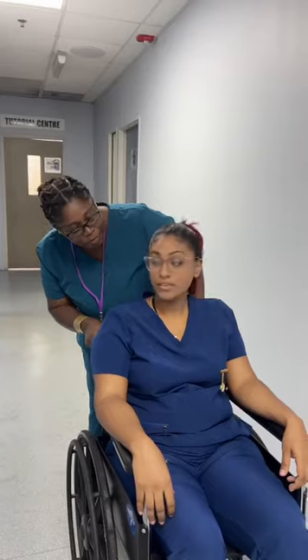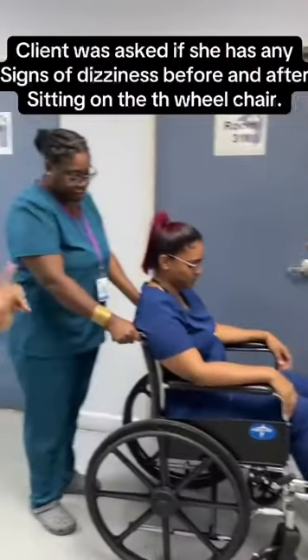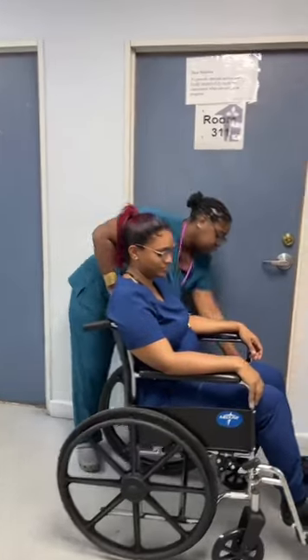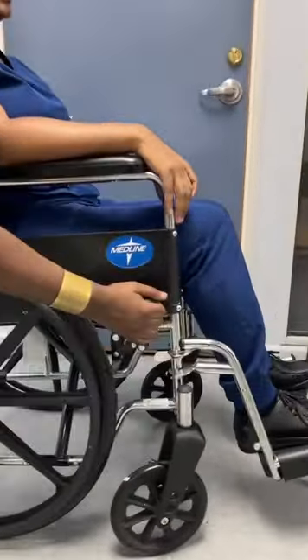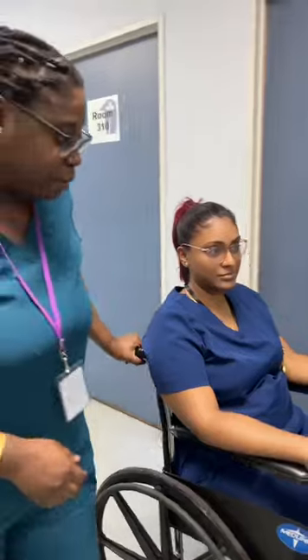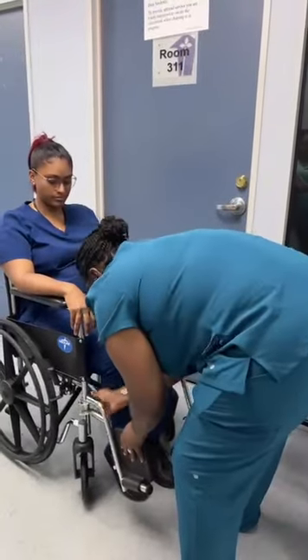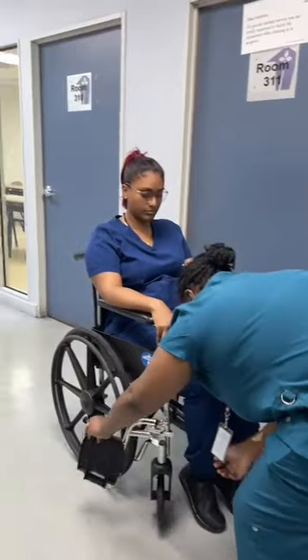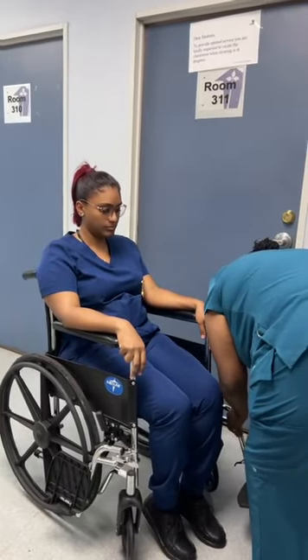Ready to go? Safety rules applied. Are you feeling dizzy? So we're gonna ambulate you. If you notice, she's moving the leg rest out of the way to prevent injury to the client or herself.